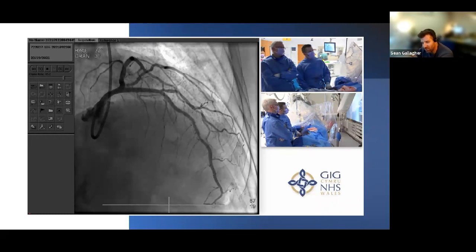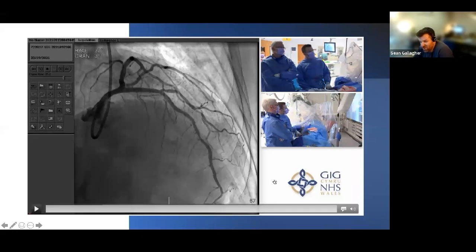Actually, what we know now is we've got the best possible result from the situation we were in. If I'm being honest, I wouldn't have wanted to start the procedure from there. I wouldn't have wanted a stent hanging across into the left main, but with that anatomy and with a stent that was old and undersized, and with the remodeling of the LAD, I think we did a pretty good job with that. We were never going to achieve perfection, but we have achieved big stents, which are apposed, which are expanded, and cover pretty much all of the disease.